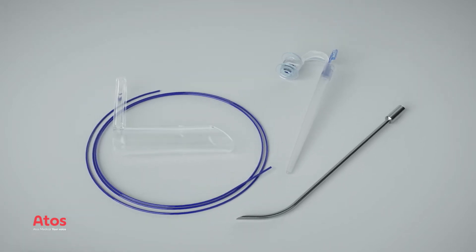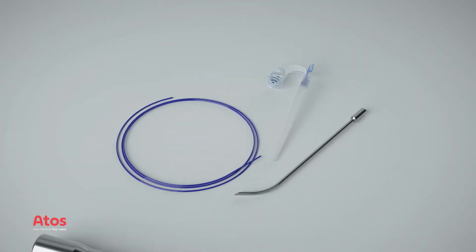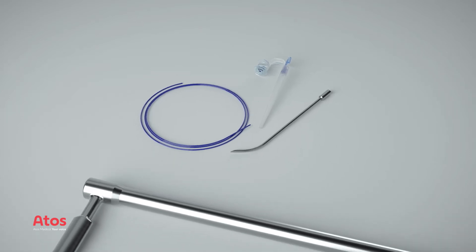The Pharynx Protector included in the Provox Vega Puncture Set is not being used during secondary puncture.